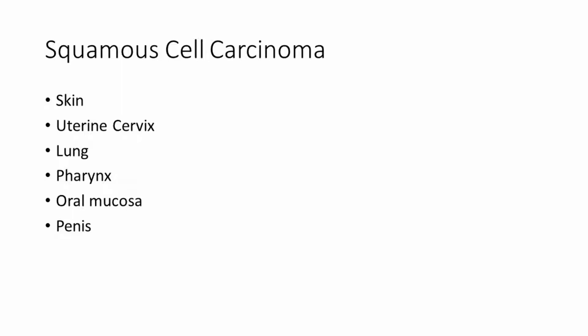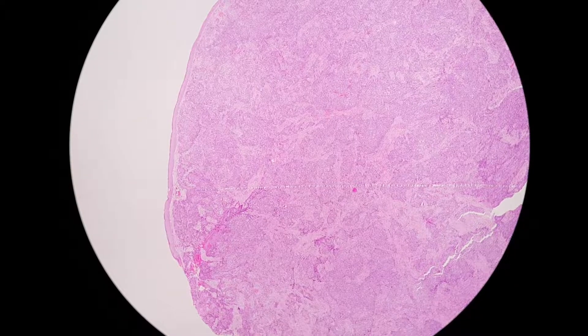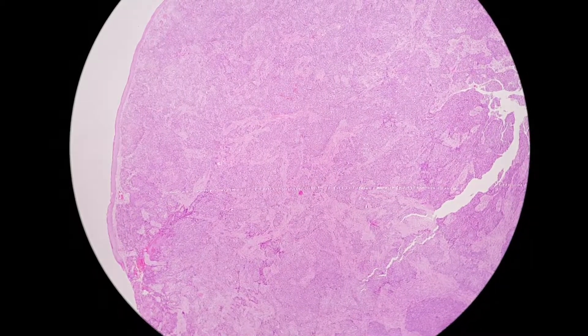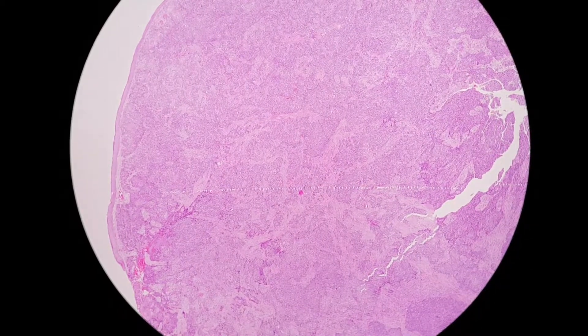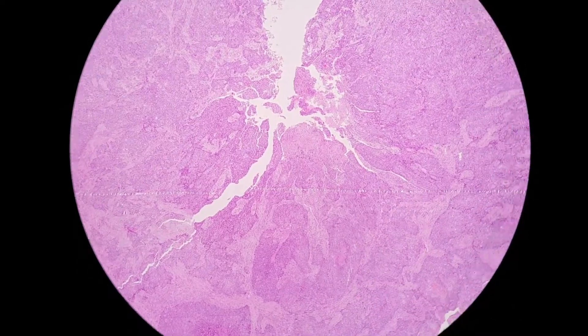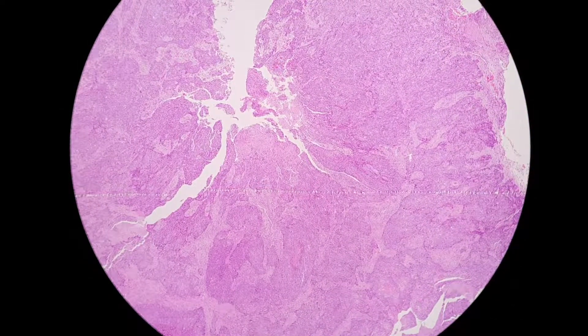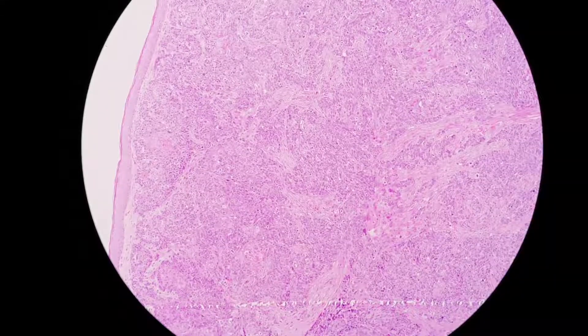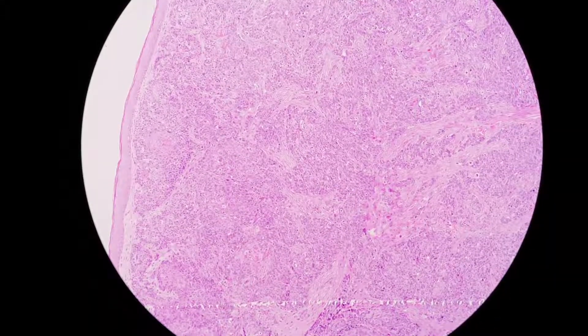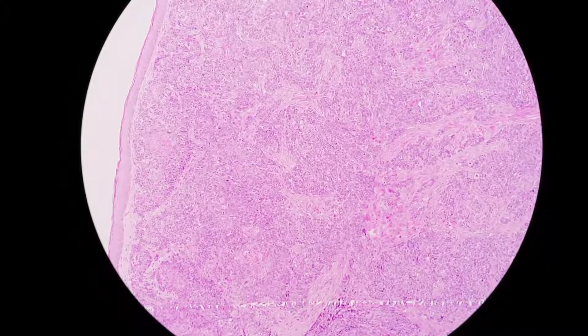Let us view the microscopic features of squamous cell carcinoma. This is squamous cell carcinoma of the skin. You can see the overlying skin on the left, and the lesion is within the dermal layer. Under medium magnification, we can see that the malignant cells are arranged in clusters and sheets.